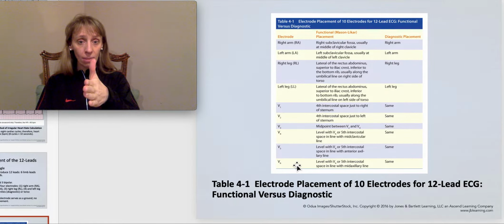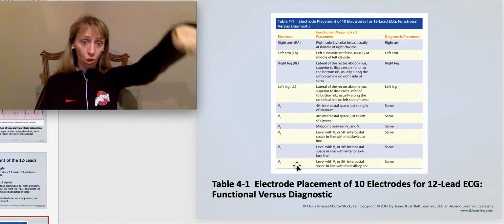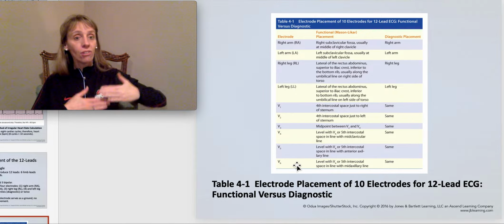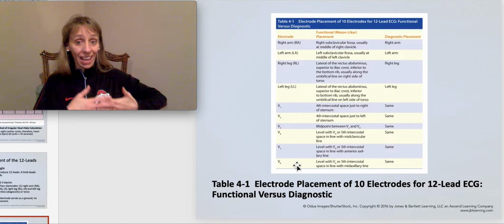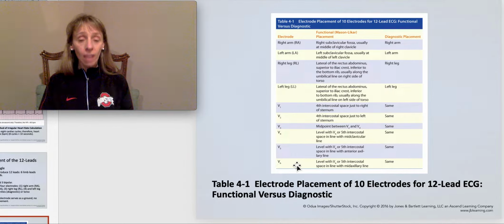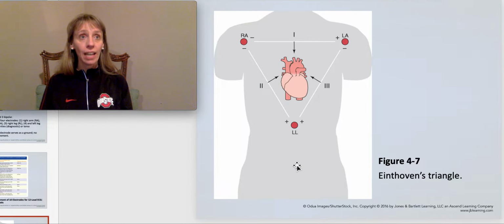So we would stop at this point and go down to the lab, and you would show me that you know how to find all of these landmarks. The left breast and chest will get in the way, so you want to be careful to go right under that left side so we get really nice, clean EKG readings.